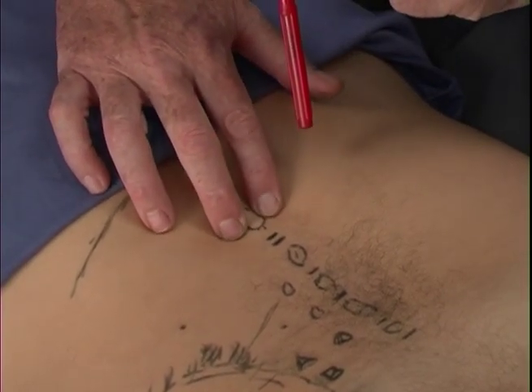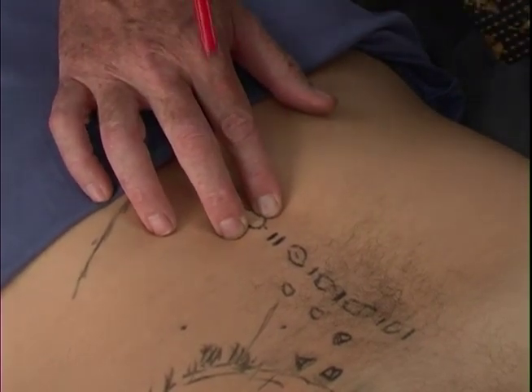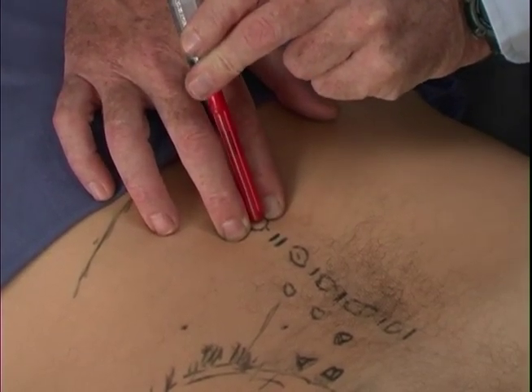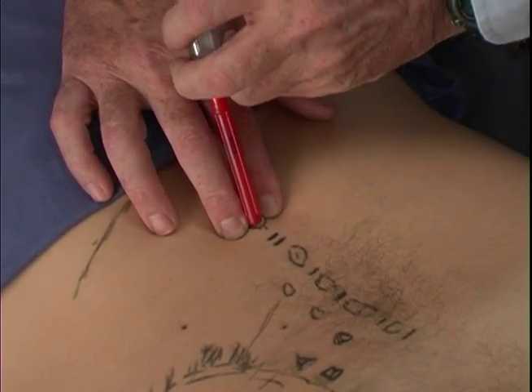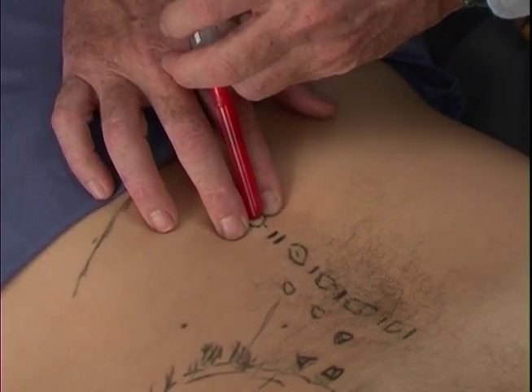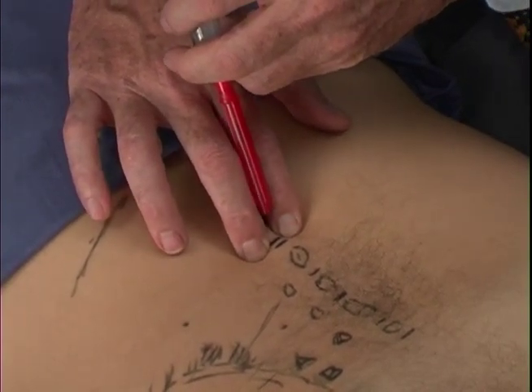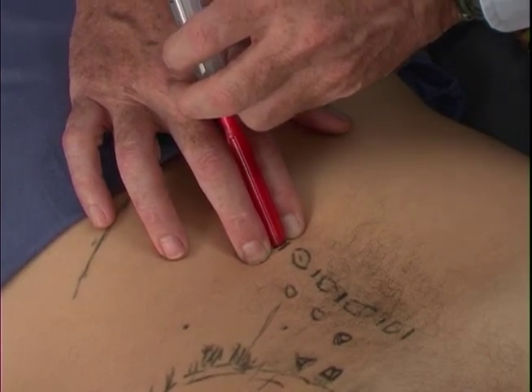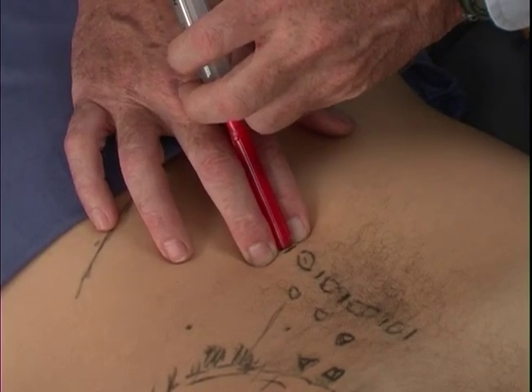We lock our fingers over the spinous process so that we can feel it directly. And then we come in, and it shouldn't be a deep injection, especially if we're pushing the skin in with our skin depression, right into that spinous process and do our injection of half cc of solution. We can then come back out with our needle and feel the interspace between the spinous processes, and then we can come down into that interspace and inject onto the top of the spine of the next spinous process.